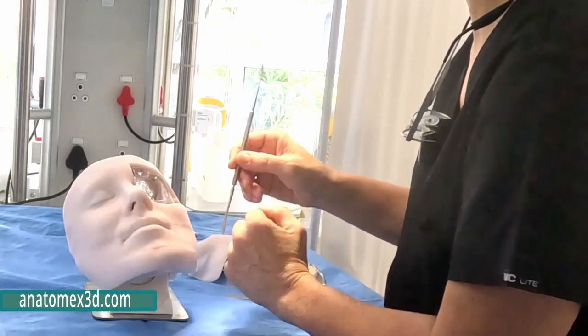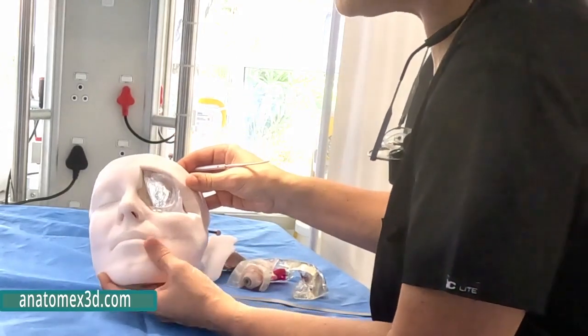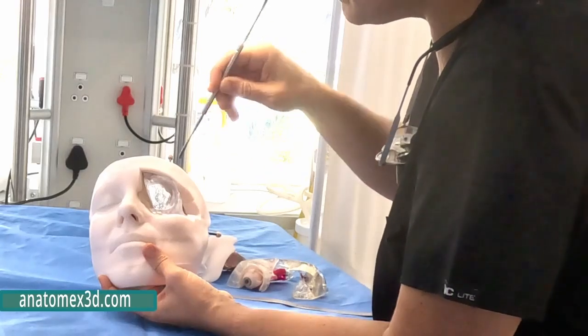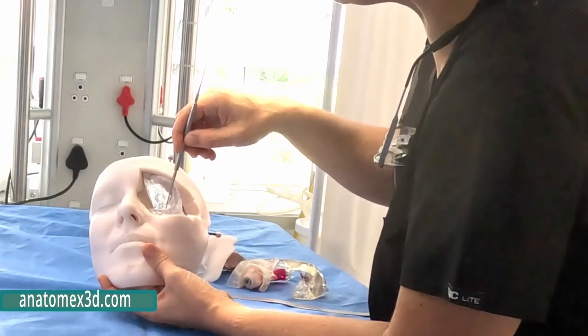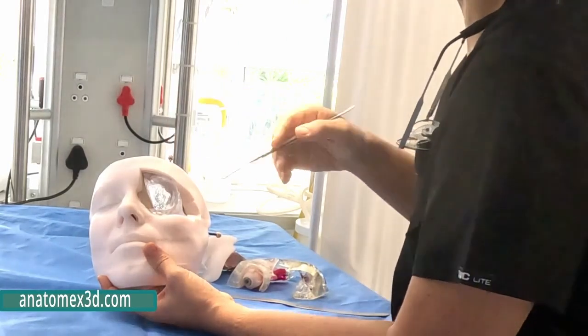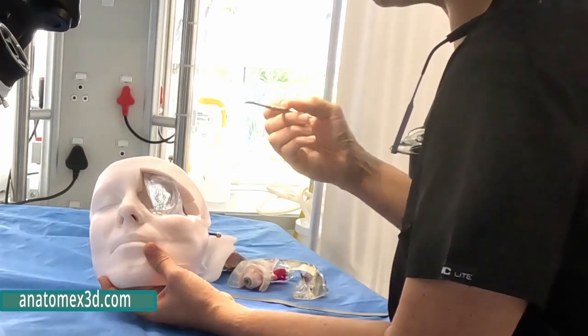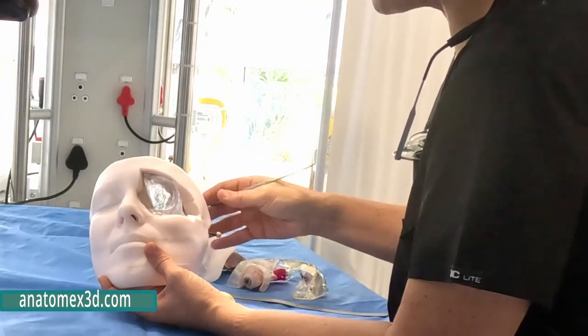So with the transorbital approach now, you can really understand and see how easy and quick it is if you dissect and you just drill away the posterior aspect of the greater wing of the sphenoid. You're going to enter that space, and it is super easy to fix it. So it really helps us understand this pathology.